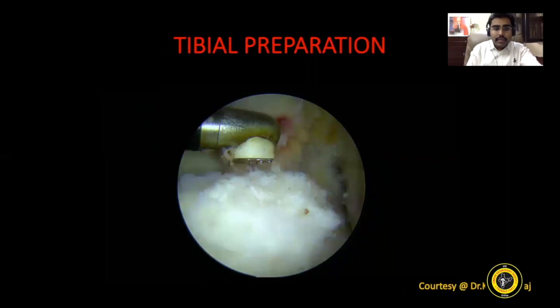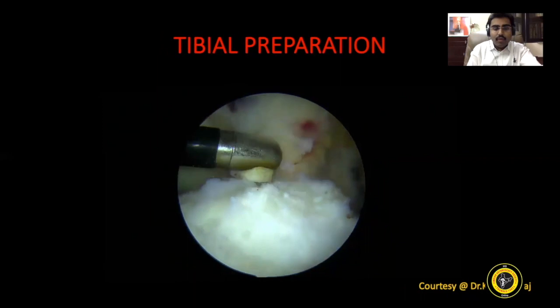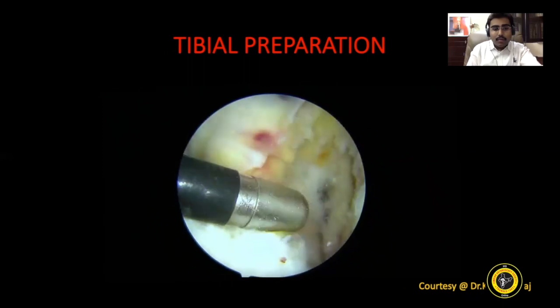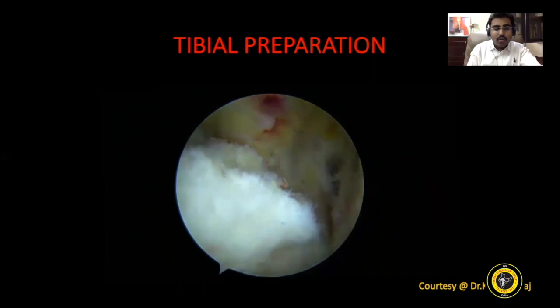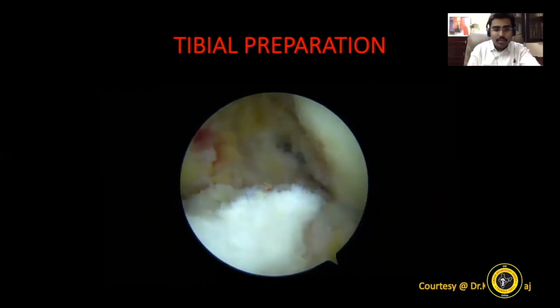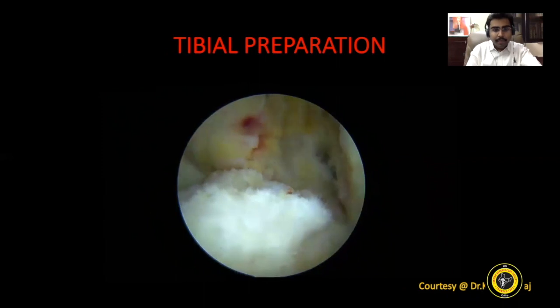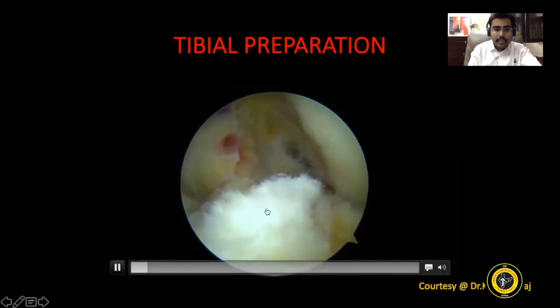The next is the tibial preparation. My landmark is very simple. I follow the stump. I do something called stump cutting. I don't want the stump to be too much, causing a cyclops lesion. At the same time, I don't want to knock off and bald the tunnel entirely, blunting all the proprioception. So that's what I call stump shaving or stump cutting, to trim it off to be neat on its head. Now, the landmark I use is the stump per se.